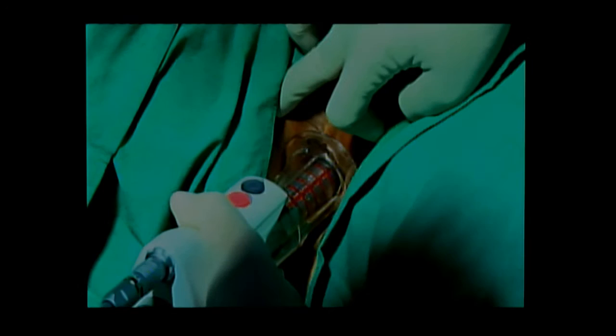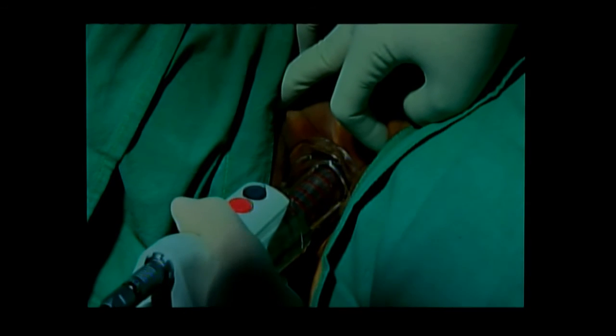This is the second pass. It's very easy to handle. You just need to keep the probe right in the vagina, touching the vaginal wall, and it does all the work of rotating, pulling outward and inward by itself.